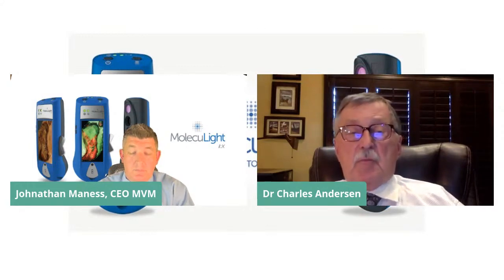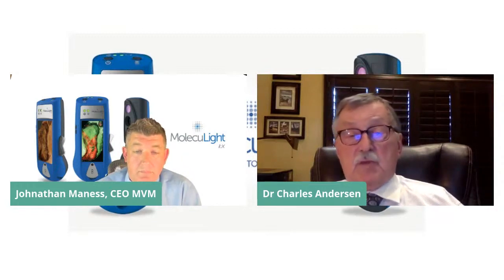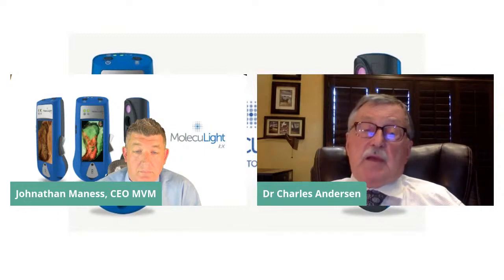Yes, I think that when you get the information so that you can come up with a care plan, and you can be very selective based on that care plan and the information from both a good history and physical and the additional information from the Moleculight, then you're less likely to be shotgunning the wound. Many times we see patients that have received recurrent treatments with antibiotics, and what they have is stasis dermatitis, for example. If you elevate that leg, all the erythema goes away. It's not cellulitis, but many of these patients have received many, many courses of antibiotics.